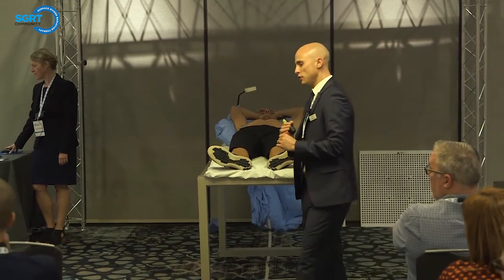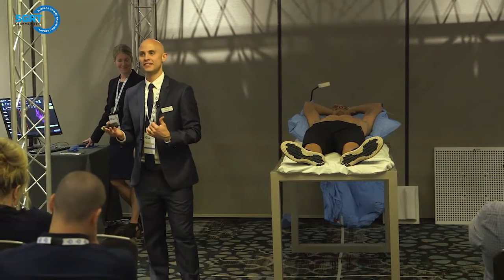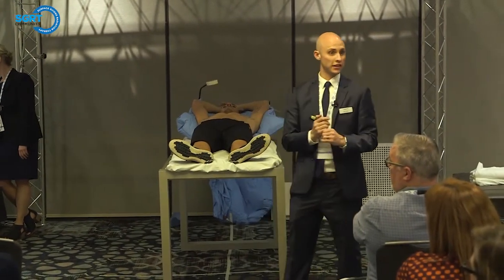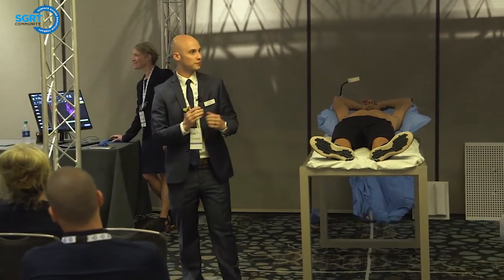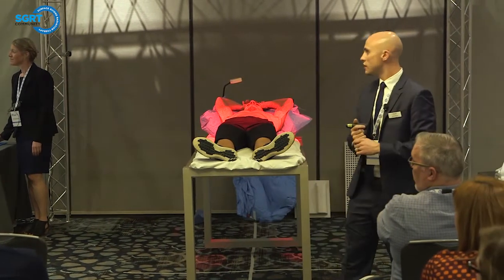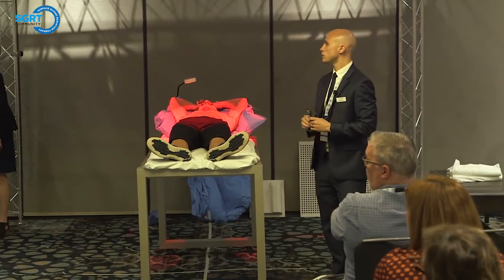So going back to our 5 steps to treat, our acronym, T stands for Treatment Isocenter. So we're going to line up our patient to their treatment isocenter, and in this case, for deep inspiration breath hold, we're on the free breathing to start out with. So we've lined up to our treatment isocenter, and next, the letter R is run monitoring. So now let's go ahead and begin monitoring. Our goal here is to fine-tune the deltas. We want to get everything as close to 0 as possible. So we're going to start with our rotation, roll, and pitch, physically moving the patient, and then moving our translational shifts just with the couch.